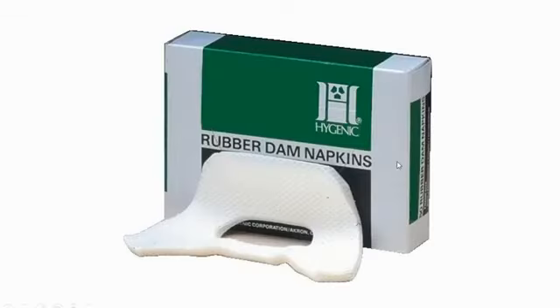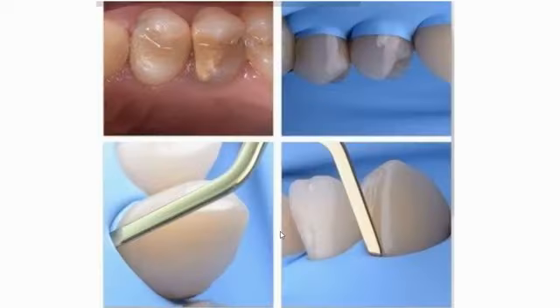So these are the rubber dam napkins some companies give. Otherwise you can make also these napkins. You just need to take a tissue, good quality tissue, and you can make a hole in between. तो आपके पास अगर अवेलेबल है तो आप टिश्यू पे भी मॉडिफाई कर सकते हो. तो स्पेसिफिकली लॉन्ग ड्यूरेशन के लिए जब आपको पता है कि आपको यूज करना है पेशेंट के कंफर्ट के लिए, यू कैन यूज दिस. ठीक है. दिस इज द फाइन इंस्ट्रूमेंट विच यू शुड हैव. फॉर एग्जांपल सी इफ व्हाइल आइसोलेटिंग द मल्टीपल टूथ्स द शीट विल कम इन दिस वे. नाउ फॉर अ गुड आइसोलेशन यू नीड टू इन्वर्ट.